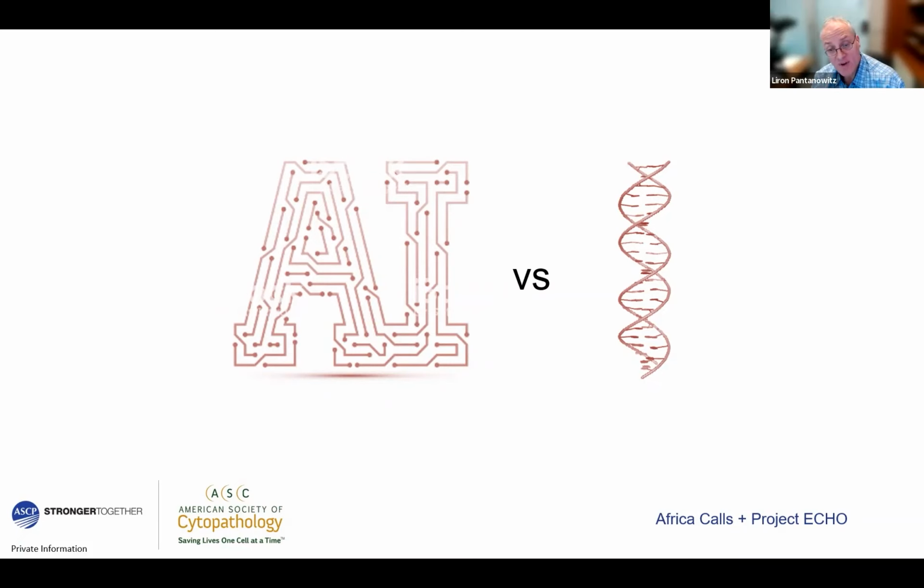One of the things that AI is very helpful at doing is applying the AI at the bedside. So there are one or two companies now in the USA where you can do a thyroid FNA for a patient under ultrasound guidance, for example, and at the bedside, you put the aspirate into a little box, and that device right there and then will do an interpretation without even staining the material, and will tell you if it's adequate or not and lesional or not, with the help of certain sophisticated advanced imaging with artificial intelligence applied to that. And that can be done at the bedside without the need for a human to review that, and obviously avoiding all the expensive molecular testing.